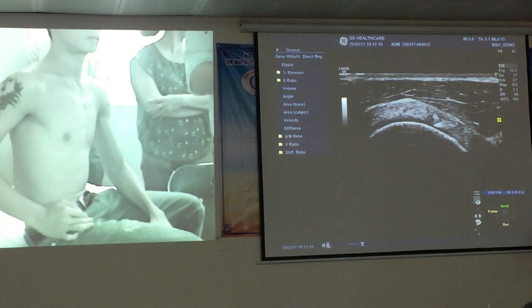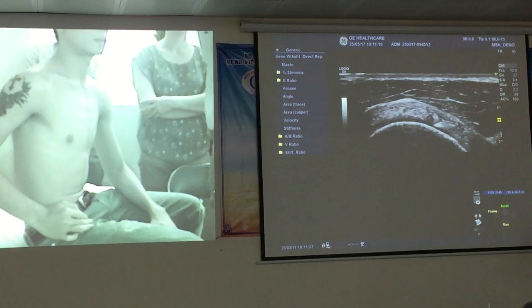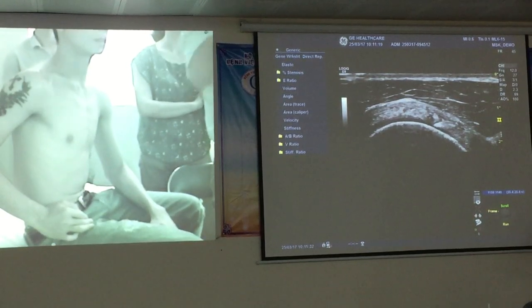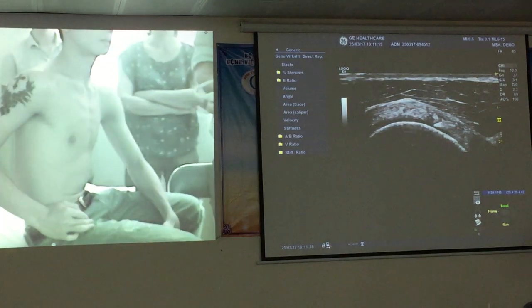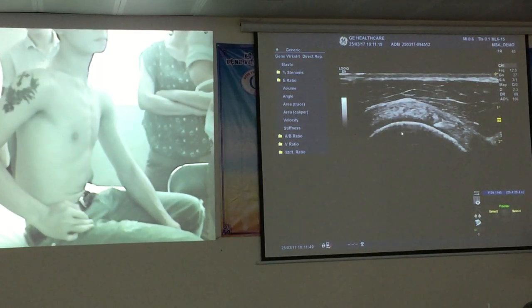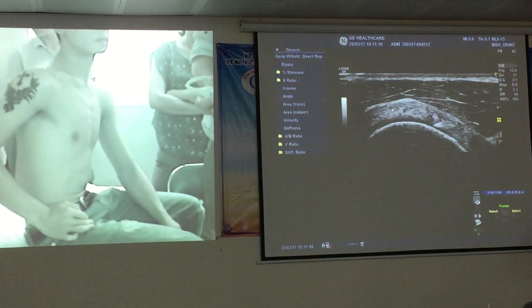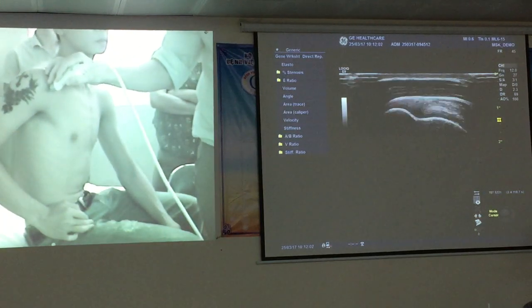What happens is the supraspinatus tendon is actually made up of 5 different tendon groups, and they all come down and interweave amongst themselves. So you can get little separations just between those little fibers as they come across. So you can see that there's a little space just there, little one just there, little one there, a little one there. So they're just the spaces in between the individual tendon fibers, so that's normal.